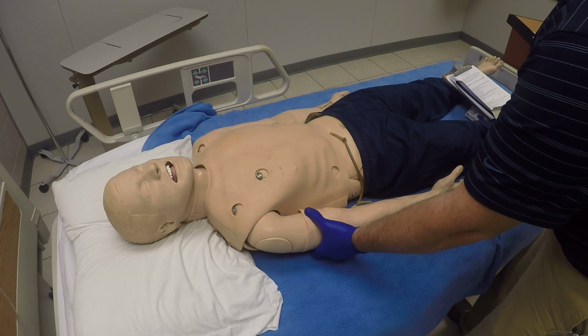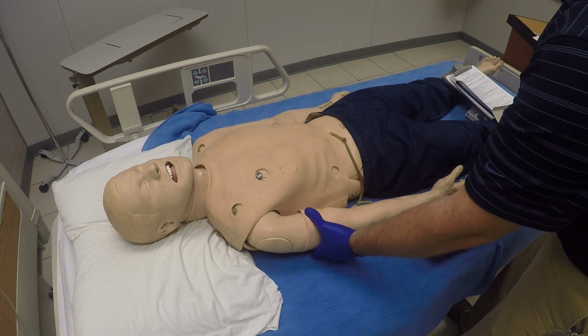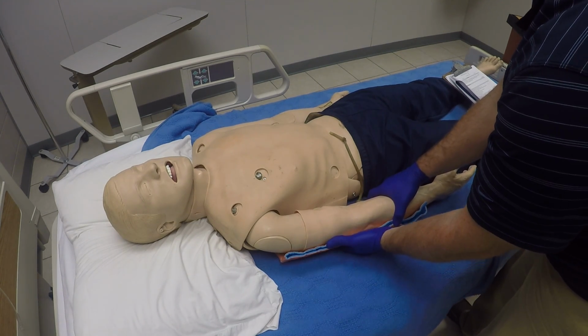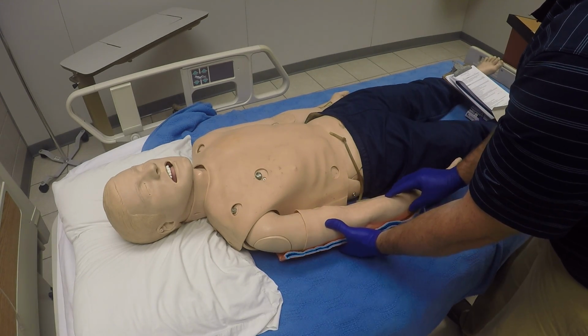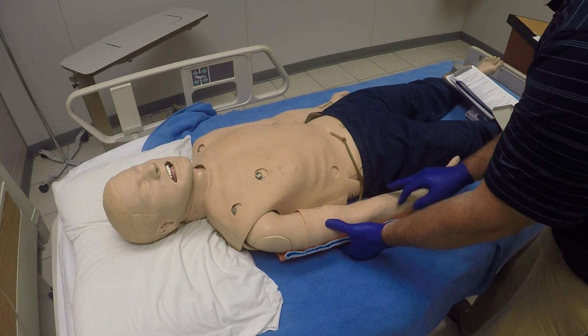And then we want to go ahead and check our splinting material, make sure it is appropriate, and put it in place. We're going to immobilize the site of the injury and then immobilize the bone above and below the injury. So our humerus and our radius and ulna, we're going to immobilize all of that. We're going to go ahead and let our partner hold on to that for just a second.